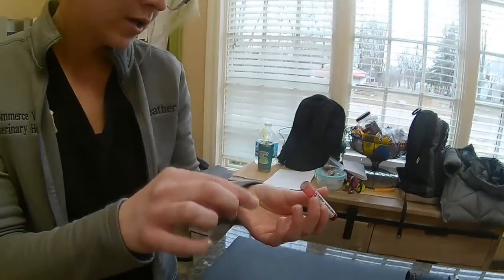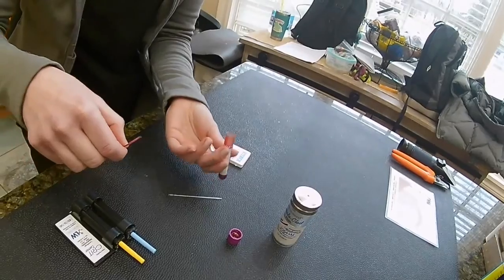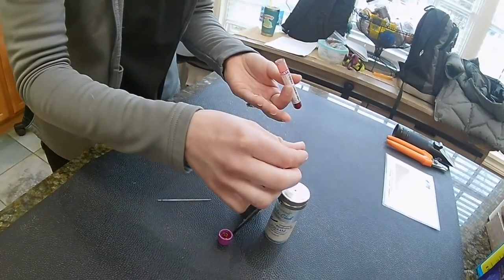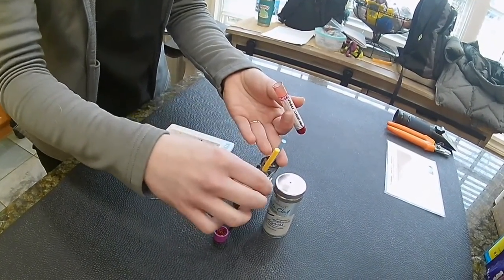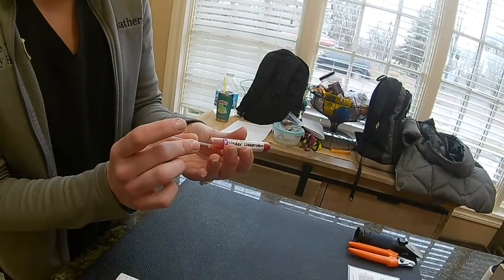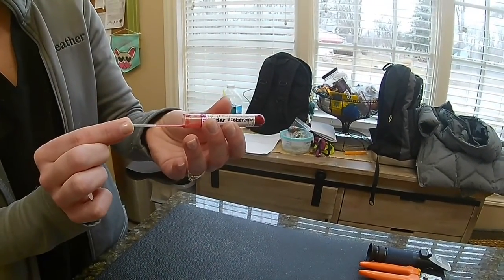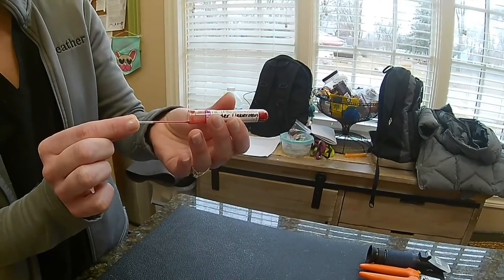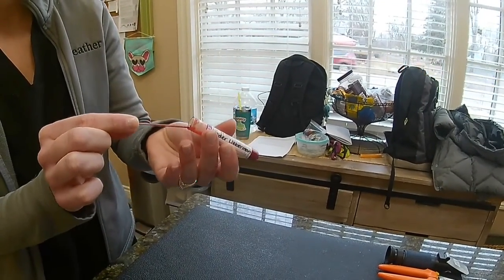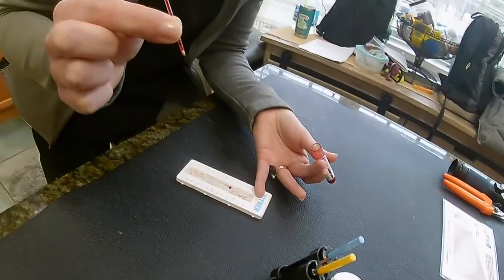Okay, so there's one. I'm going to pack it with some clay here. And then I can ideally just set that in there. Alright, we'll do another one here. Yeah, it's kind of hard to see. Move my fingers out of the way a little bit. I can make a little bit less of a mess with this one. Okay, so I got that nice and packed on the bottom.